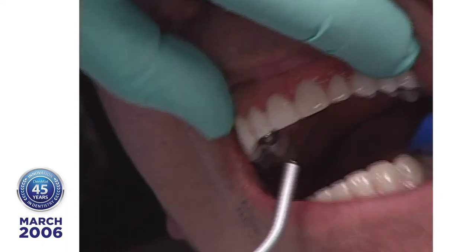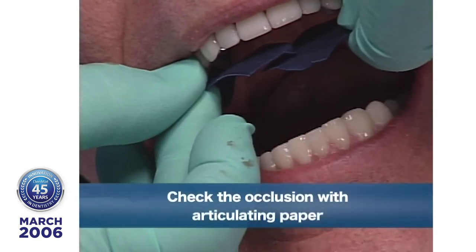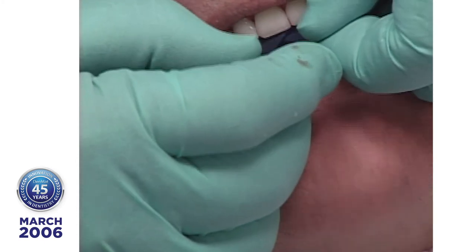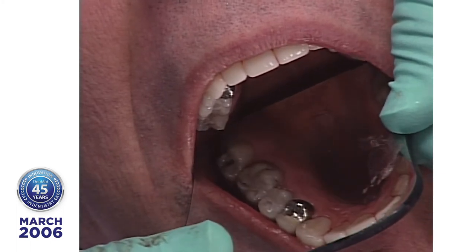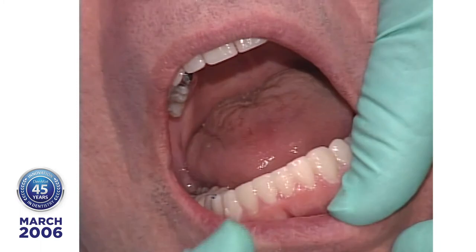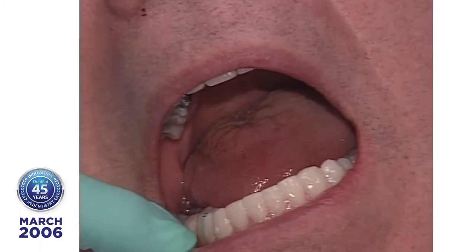Now, let's take a look at the lowers here and see what kind of marks we have. Now, let's take a look at the lingual side up here, the maxillaries. And they're about 80 to 90% finished. I always tell my patients they're not finished yet. Let's take a look at the mandibular.